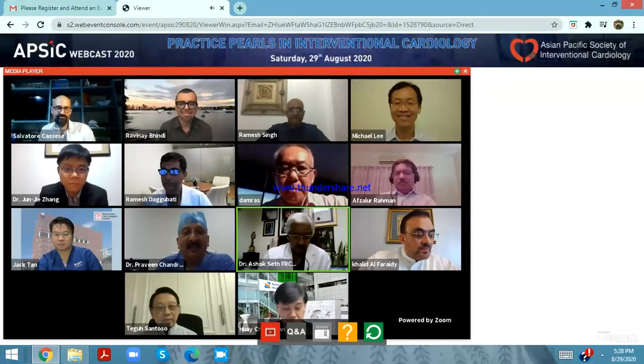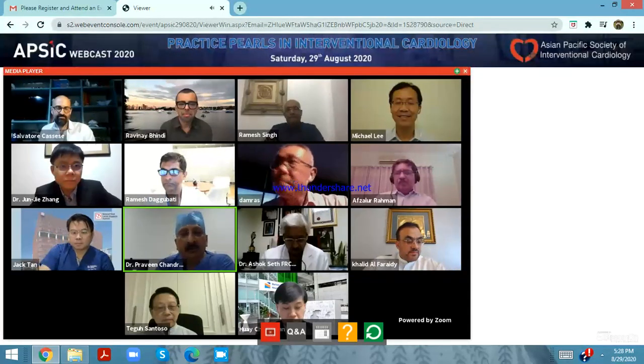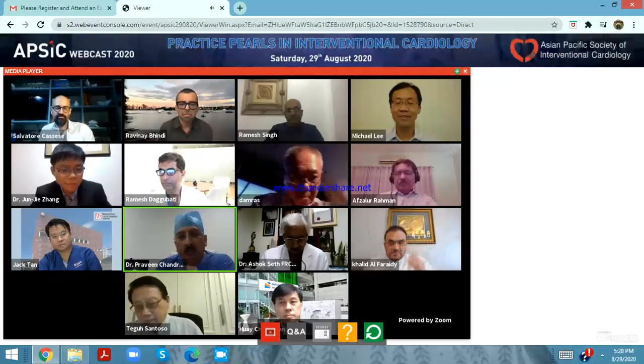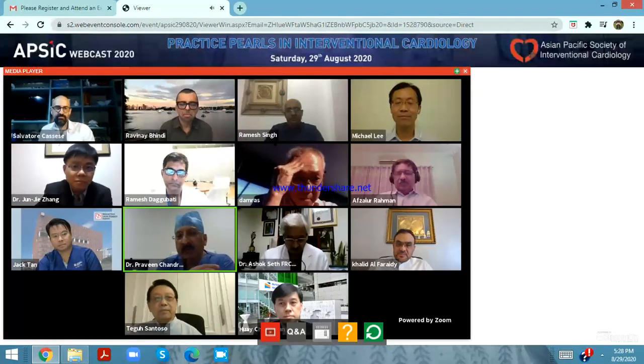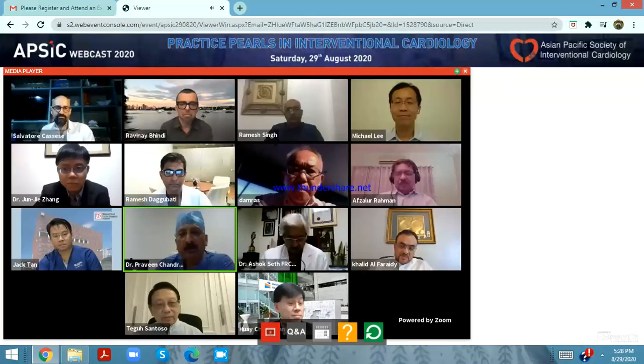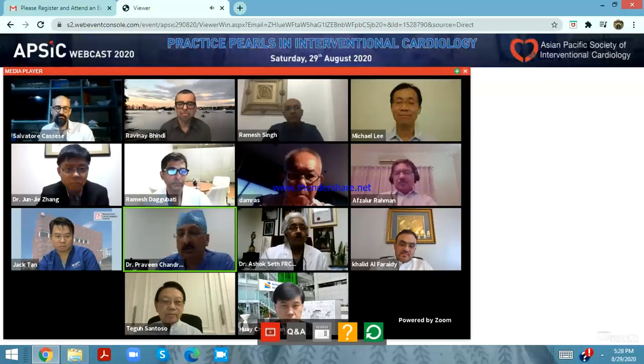I saw a very interesting case shown by Dr. Kasisi, where after the IVL, we had to go for an open NC balloon. In fact, I have a couple of patients where we finished all the pulses with the IVL balloon, and it was not responding. Finally, we went with the open NC balloon to very high pressures, and then we could crack it. So maybe the IVL just loosens it a little bit, and then we can do it later, because it still needs some pressure.